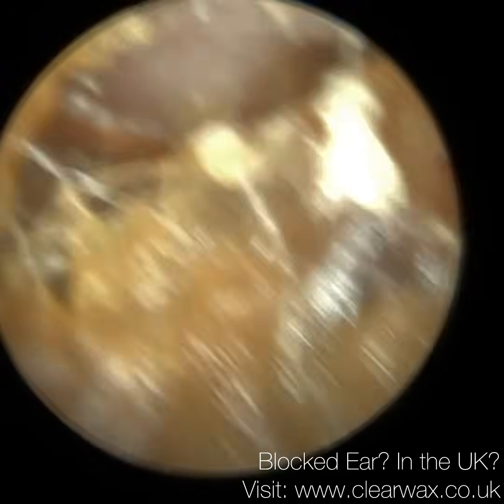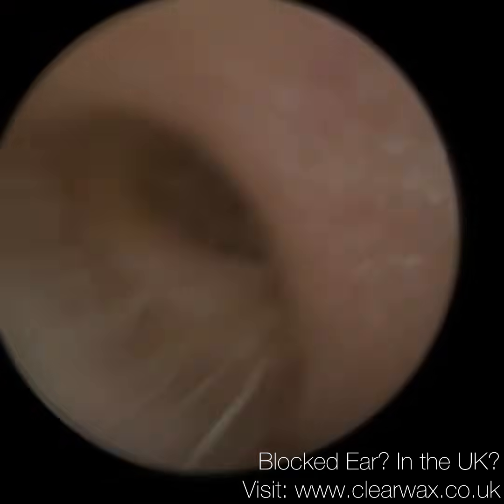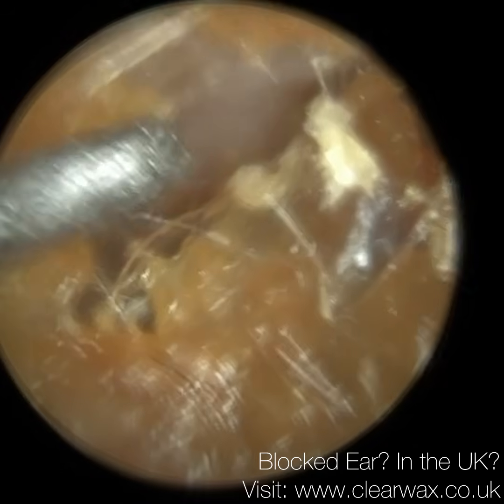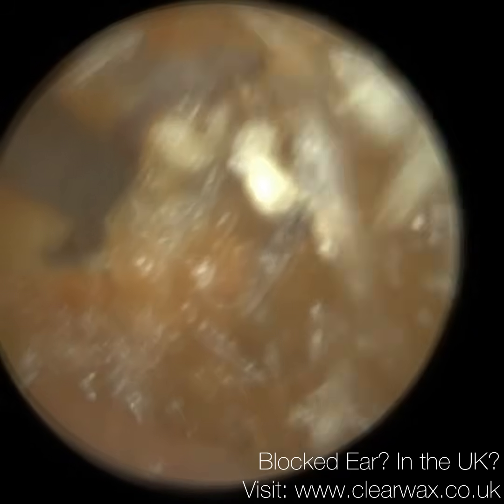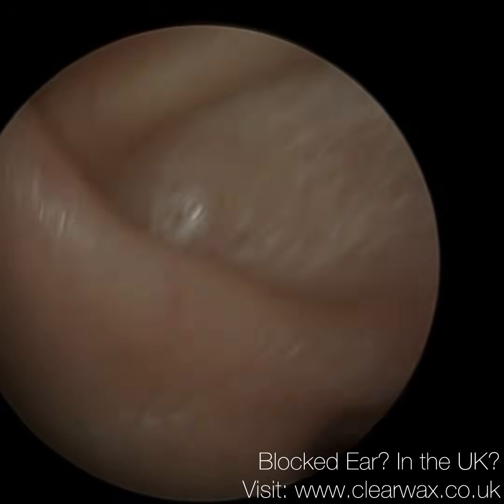And here we have a patient who attended with bilateral benign osteonecrosis, and I'll explain what that is during the course of the video. So this is the patient's left ear. It's not fully occluding, it's an opening at the roof of the ear canal, hence why I'm beginning the procedure using the right angled ear hook. But as soon as I try to bring this out, it just kind of cut through it.